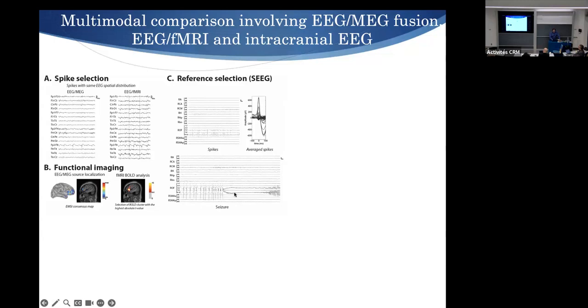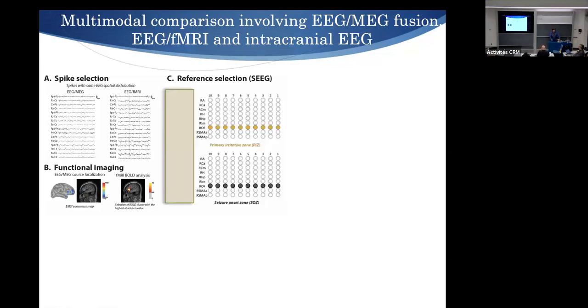And from the seizures, we defined visually the seizure-onset zone, and we also defined the most important sensor in SEEG, and this is using something called the epileptogenicity index. There are 2 schools to estimate that, either Marseille or Grenoble. We're using the technique from Grenoble here. So that's where we start.